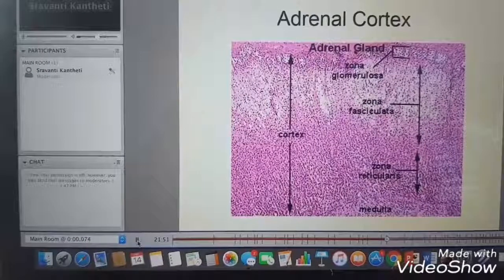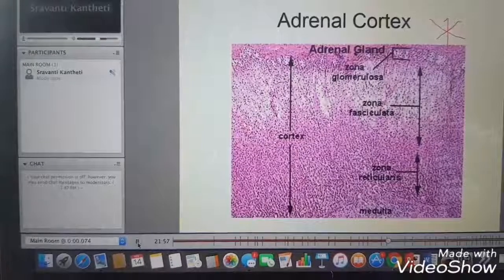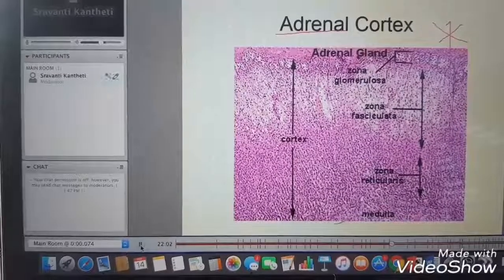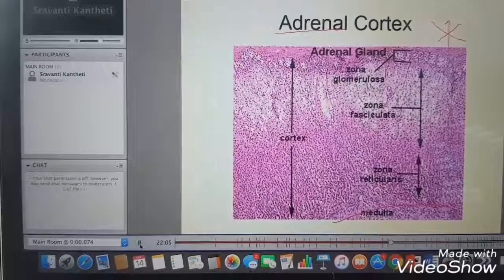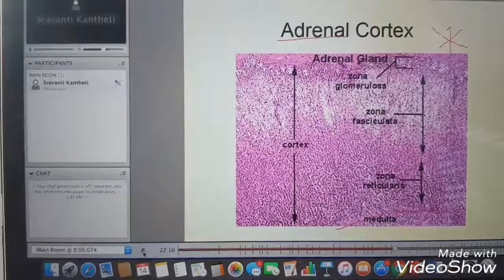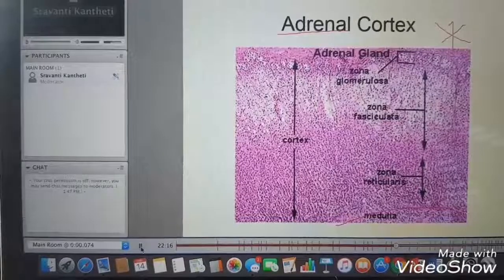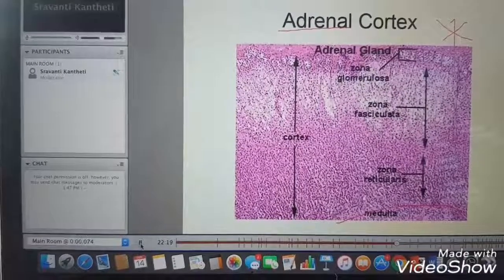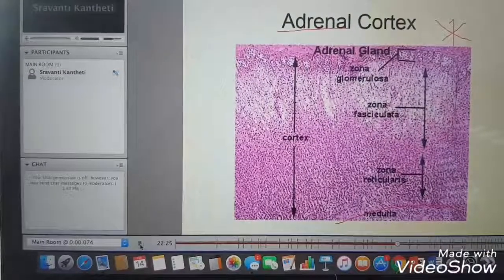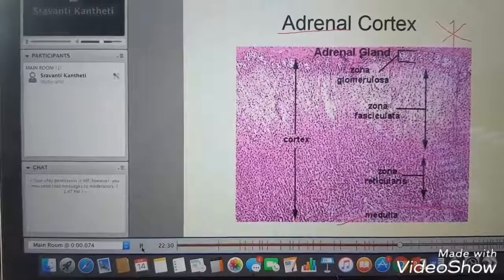All right, so this is what I star highlight. The cortex of the adrenal gland itself has several layers. Okay, before we get down to the medulla, we have 3 major layers of the adrenal gland, and your textbook goes through this, and you've also done some matching activities on Mastering A&P, so these terms should be a little familiar. I won't expect you to actually understand this. This is why I'm doing this, because how in the world can you guys just read that and do some click here and there on Mastering and be able to know what this is? I couldn't learn that way. So I'm assuming you guys aren't learning that way either.